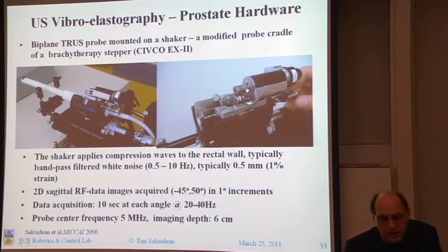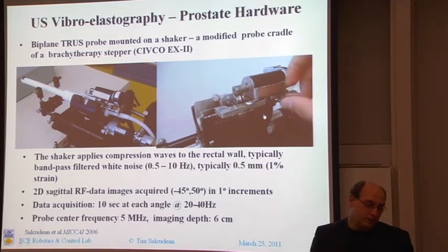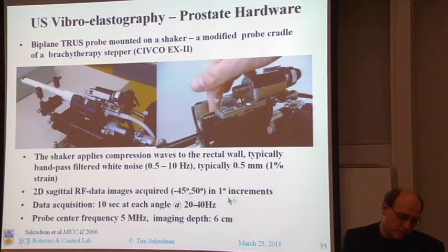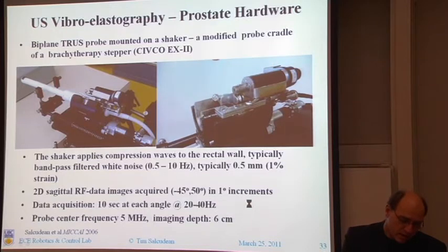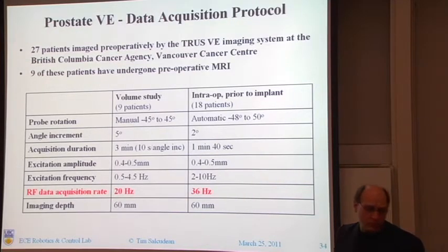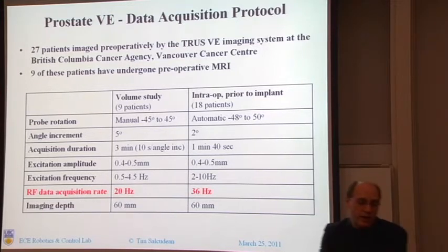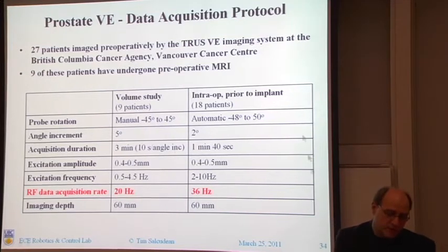As you move it closer, you see more of the angle of the variable angle cam, and that gives you transmitted waves through the prostate. We see here we have 9 patients that we acquired data for at the volume study. So this is before you actually go and have your treatment. It's at the time of the treatment plan. And then we have an intra-operative set of patients which we've done prior to their brachytherapy procedure.